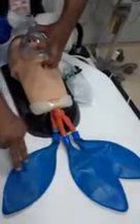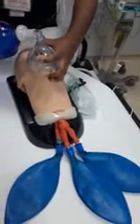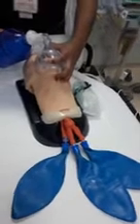One thing you notice, these two ports are for the lungs and this is the gastric port. When bagging, somehow air will go to the stomach as well. So this is a temporary measure. If you can see properly, the air is also going toward this end as well. This end is our stomach end. These two are the lungs. So please keep in mind that by bagging, you are also inflating the stomach somehow.